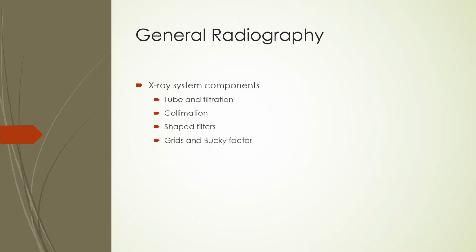In radiography, as in most imaging, the X-ray tube and the image receptor are the main components. The X-ray tube produces X-rays when energized. The X-rays pass through the patient and are collected by the imaging receptor. The quantity of X-rays passing through the patient may be set manually or controlled by an automatic exposure control system.